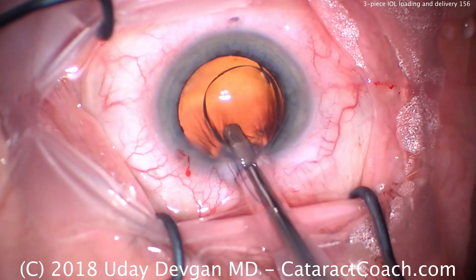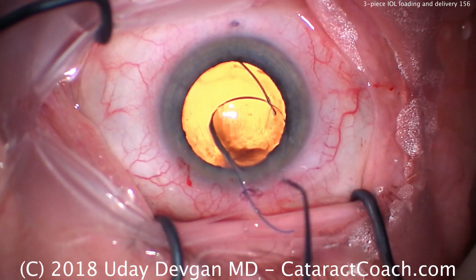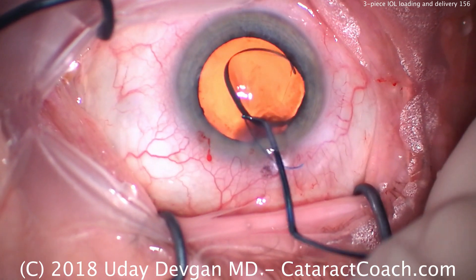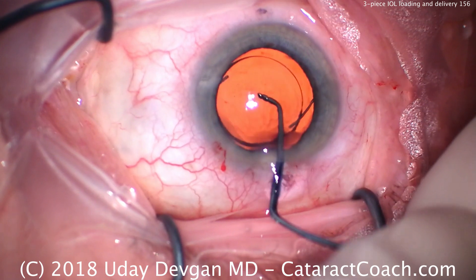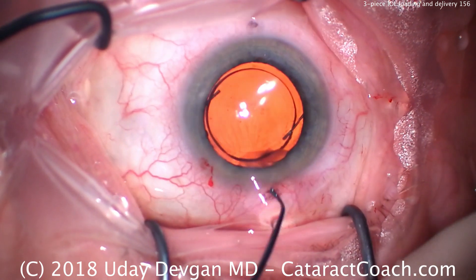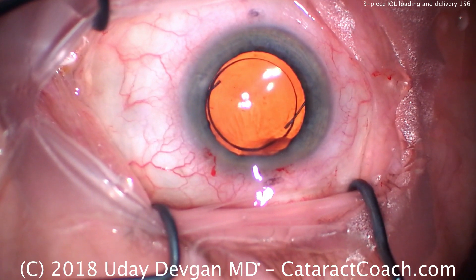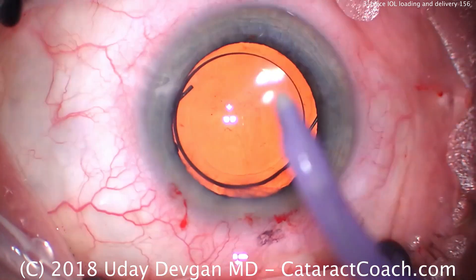Very important: when you push the lens down the funnel shape of the injector cartridge, watch the leading haptic. If it flips, then you must also flip your injector tip as you advance the lens down the plunger and as you put it into the capsule bag. That looks great. Now we can go behind the lens, remove viscoelastic, clean up, and finish this case.